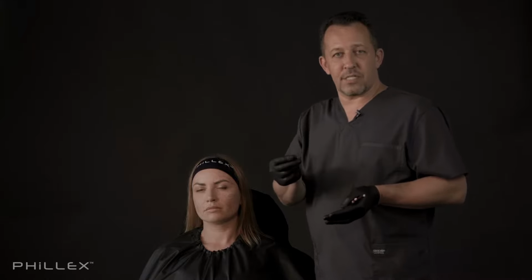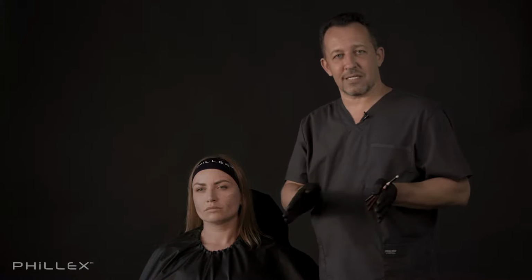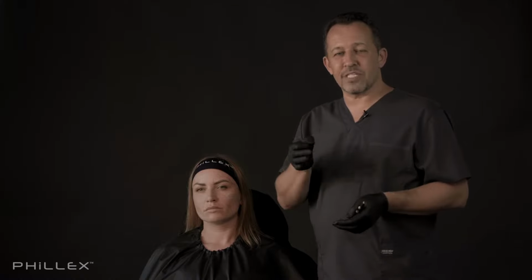We have to know the anatomy, the placement of those vessels, and one more thing: it doesn't matter which area we are injecting, one of those dangerous, or we are somewhere near, below, or upper, doesn't matter where, we have to always make the aspiration test, and it has to be not less than 10 seconds in length. We are making the aspiration test at least 10 seconds, we know anatomy, and the risk of injury during our injection goes down 10 times.